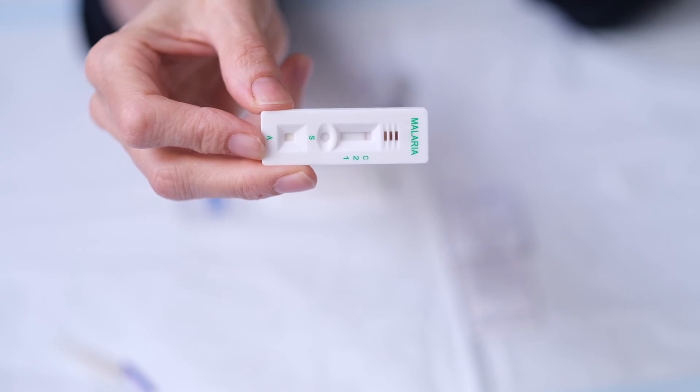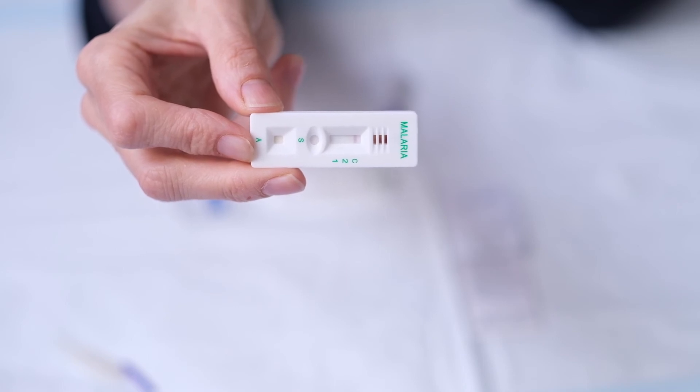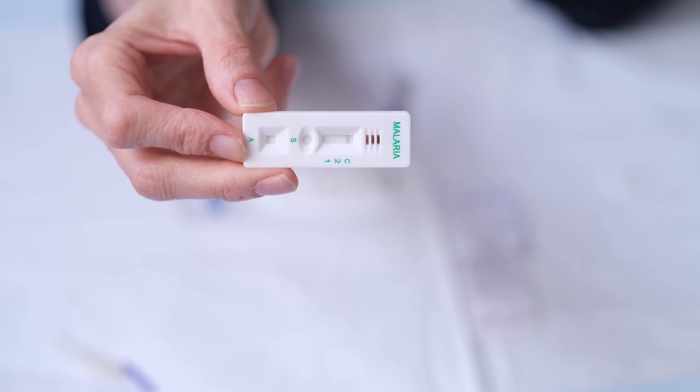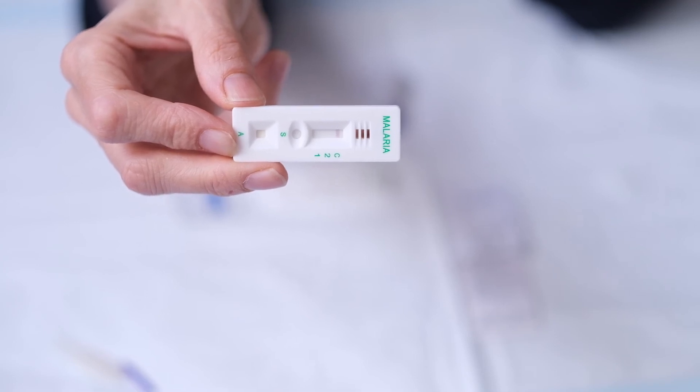The test takes 20 minutes to run through and get a result. Here is a cassette that we did earlier. You can see there is a purple line next to the C. That's the control bar means the test is successful and there are no bars next to the 1 and the 2 which means that you don't have malaria which is very reassuring.